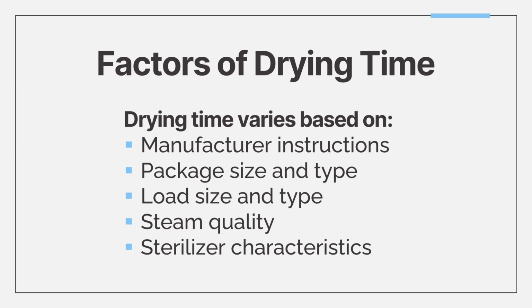A fully loaded sterilizer will need more drying time compared to a smaller load because of the increased moisture content, right? And potential for steam to get trapped between items. Of course, steam quality, as mentioned, is very important.